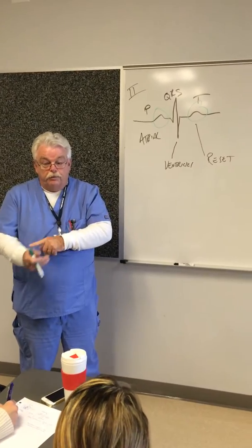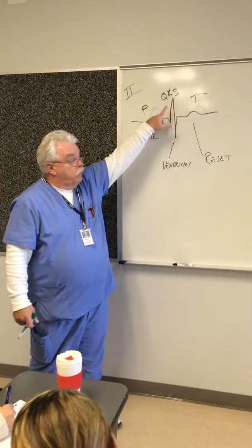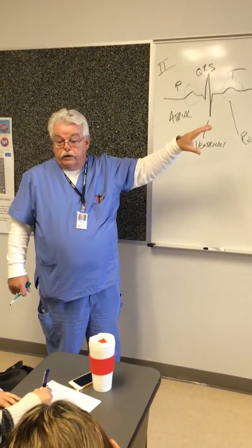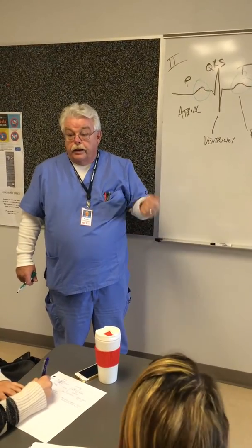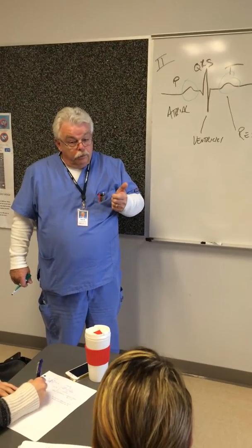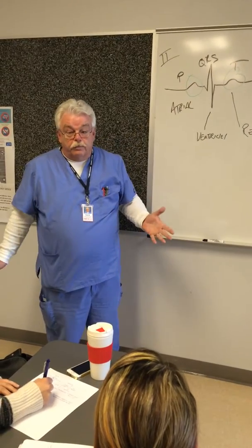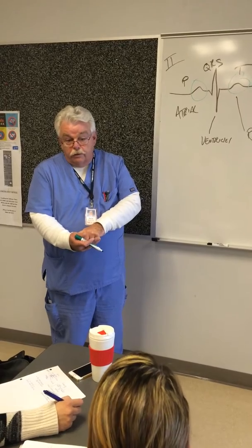When you have your finger on a pulse point, you're just feeling thump, thump, right? That thump is correlated right here. So if you ever get screwed up in these rhythms as to what's doing what, or if he has a pulse or not, if you have this, you're gonna feel thump. Unless, remember the pool pump, unless there's no water in the pool, right? The electrical system is still working, but there's nothing for the pump to pump. You're not gonna have thump down here because there's no fluid in the pool.